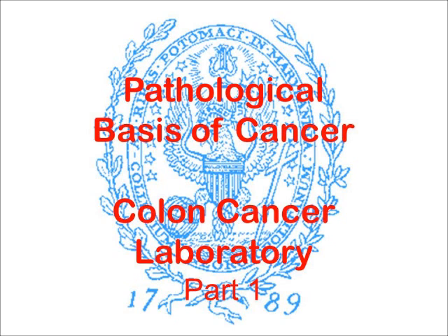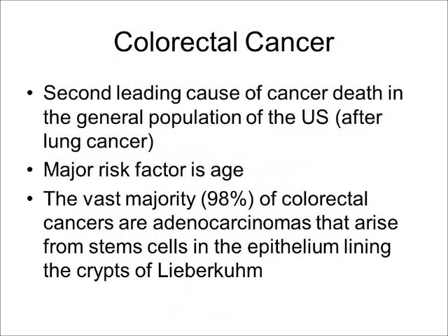The learning objectives for this laboratory are that by its conclusion, you should be familiar with the normal structure of the colon, be able to identify an adenomatous polyp as well as invasive adenocarcinoma, and finally understand how to stage colon cancer. In the present video, I will cover some of the general features of colorectal cancer as shown in this slide.